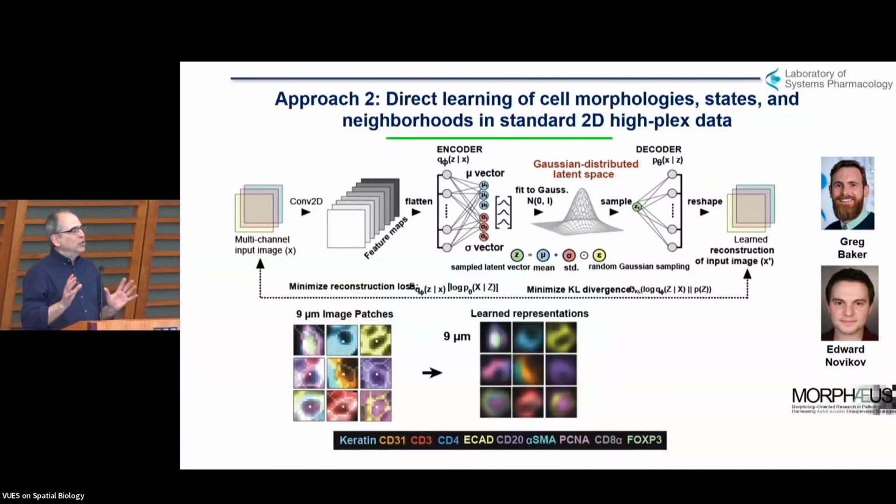And that's because they're looking at three things we now understand. One is intensity, the second is morphology, and the third is neighborhood. Because implicitly, when you look at a tissue, you're seeing its neighborhood features. And we've now begun to build machine learning tools that can do that.